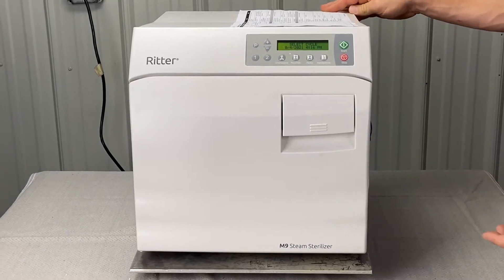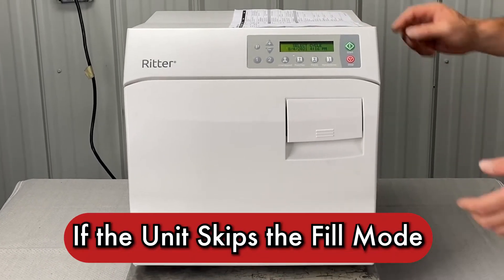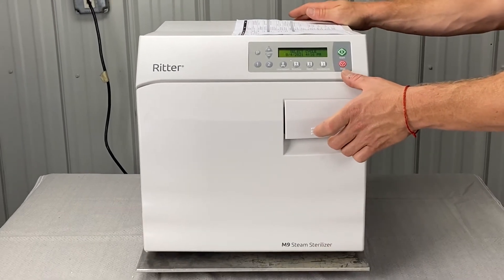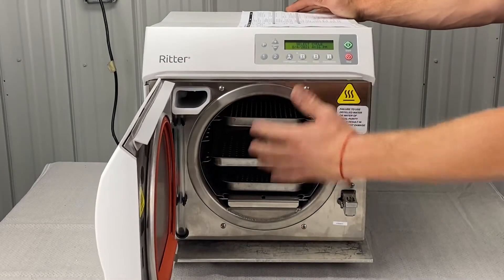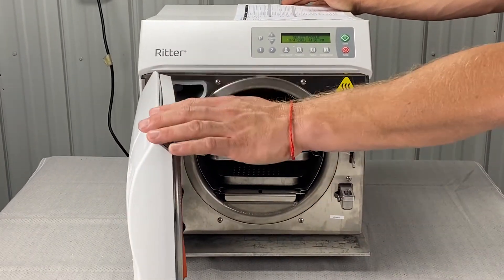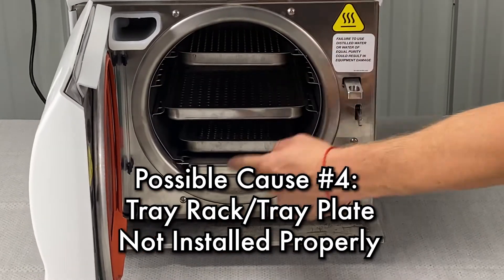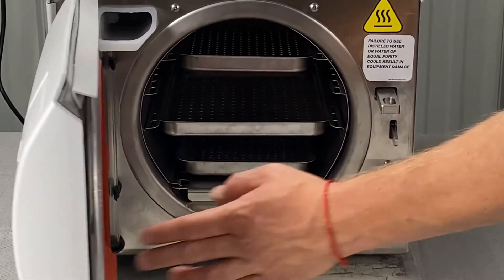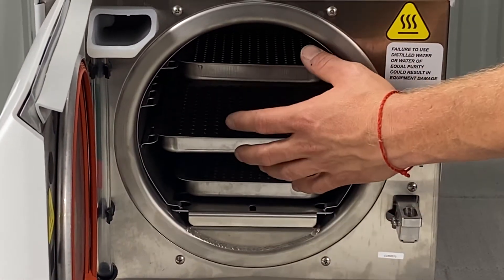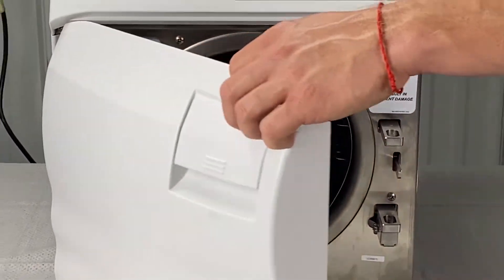So let's visually inspect all that. Also, if the unit skips the fill mode — obviously this is hot, it failed an error code — we're going to let it cool down. Open the door and make sure that the tray rack and tray plate are pushed in all the way, about an eighth inch back inside the chamber. This should be a test empty cycle at this point.